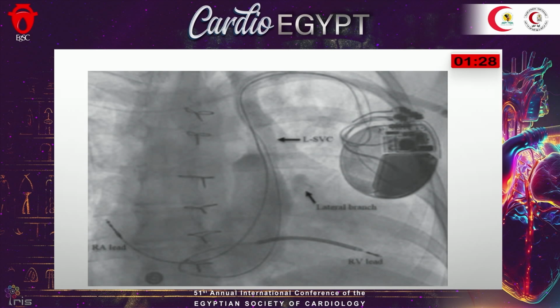How can I go? That's why I need special catheters, special long sheaths with special curves so that I can navigate the ostium here. Sometimes we enter with a decapolar steerable catheter from above or below and make a carrier wire so I can enter over it. Sometimes, if there is stenosis of the CS, this is called a snare. I enter with a PTCA wire 014 from the femoral, with femoral snaring of the wire so that I pull the ostium a bit, and make a carrier wire for the CS lead so it enters from the right side.